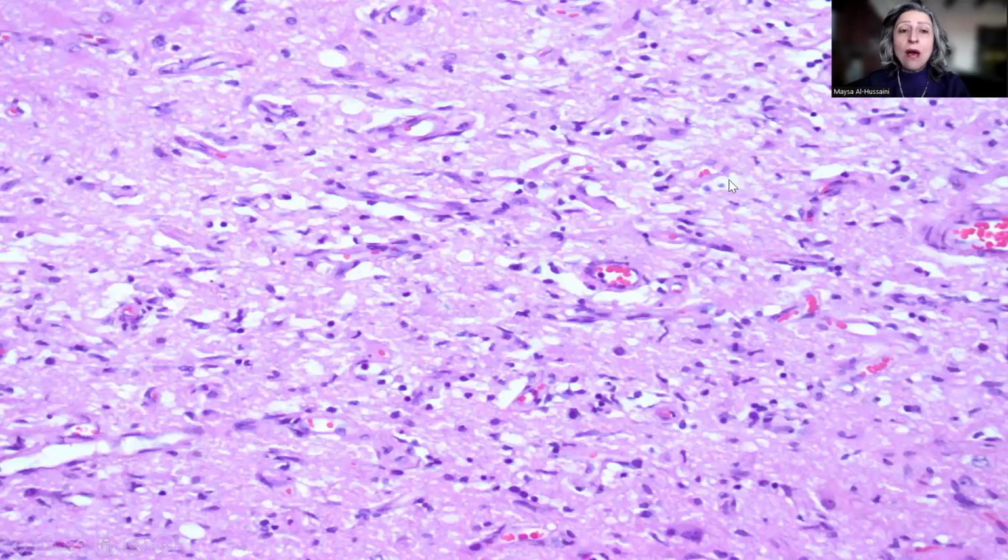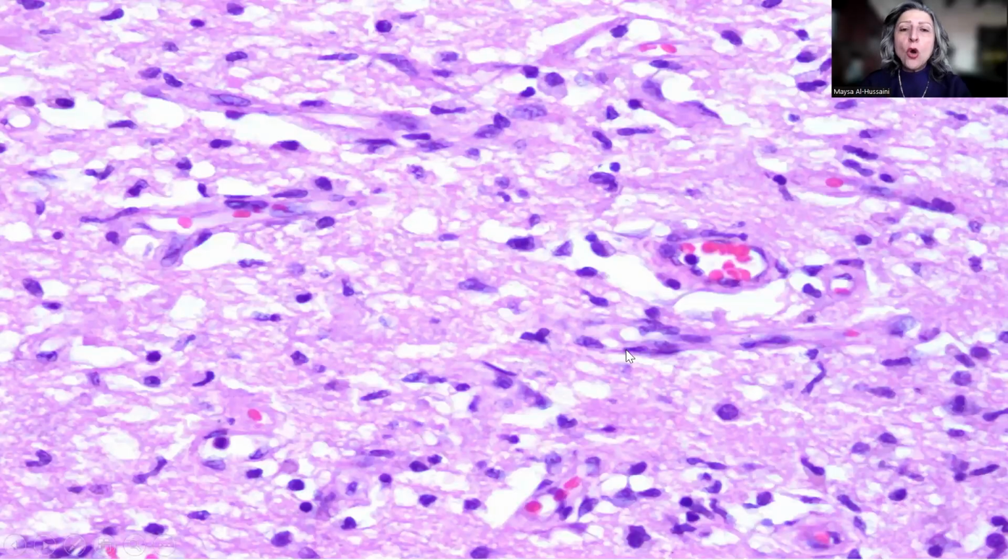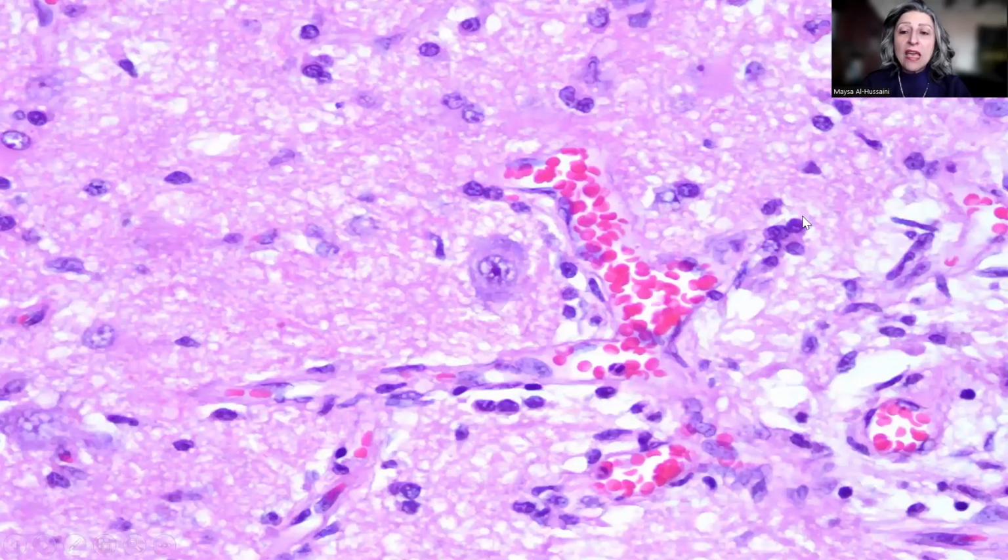As you can see on higher power magnification, there is complete destruction or disruption of the cortical architecture with loss of neurons, but it is still very busy. On higher power magnification, there are no neurons, some inflammatory cells perhaps here, some normal vessels that are present in the cortex, but barely any neurons present. At one focus, at the edge of the area in which we have some busy cellular component, there were some scattered normal appearing, and this is extremely important, normal appearing ganglion cells.